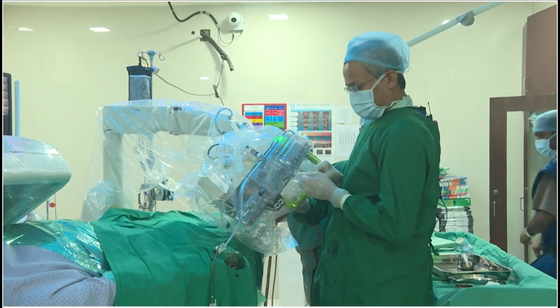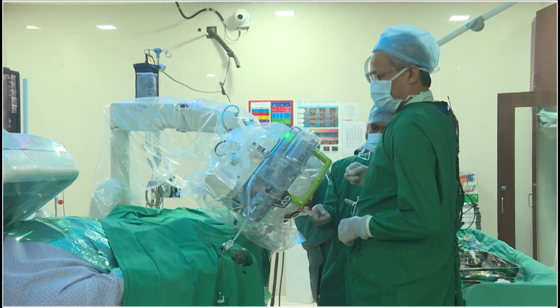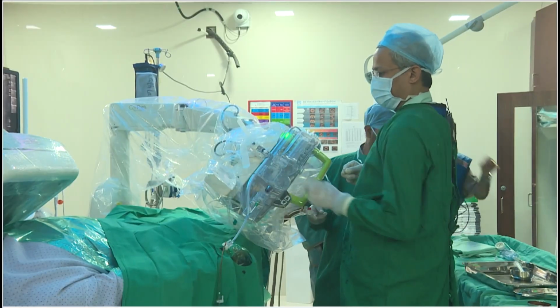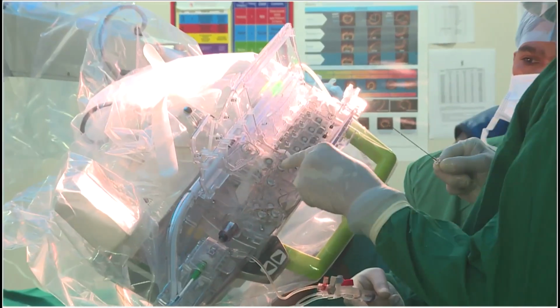So now we are going to exchange the device. We'll press the load exchange device button over here. The robot is preparing to exchange, right? It has asked us to open the cover. We are opening the cover. So this is the guide wire cover. We have to place the guide wire over here. This is for the exchange of the balloon, right?